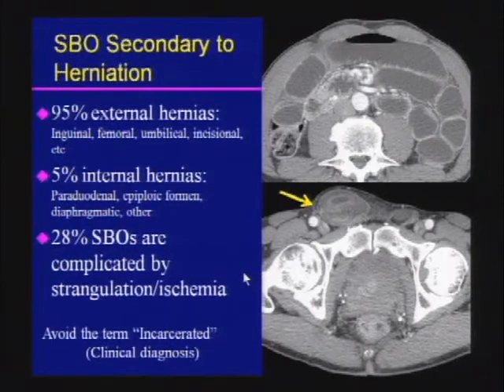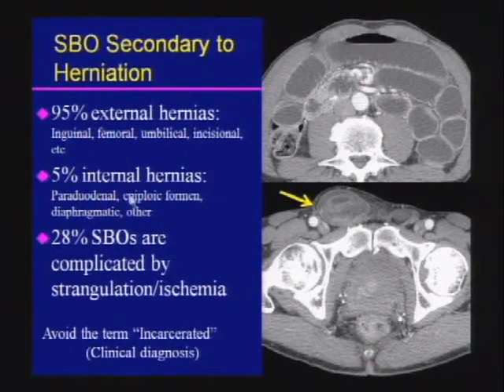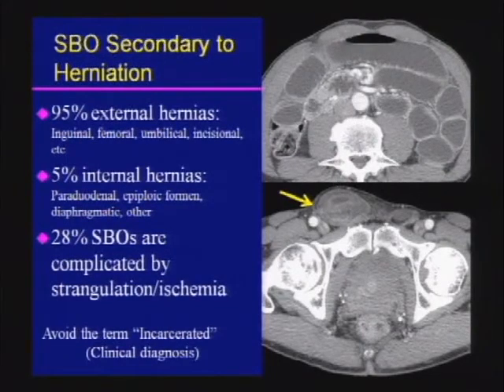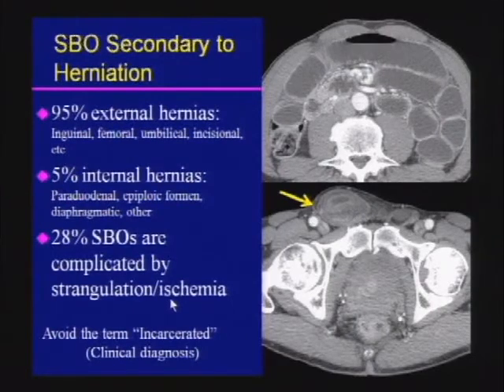A word about small bowel obstruction secondary to hernia: external hernias are the most common cause, with internal hernias making up a smaller percentage, although you should be familiar with the appearance of a paraduodenal hernia and other rare hernias such as the epiploic foramen hernia. We see obvious dilatation involving the right inguinal canal. Try to avoid using the term incarceration on your reports, as this is a clinical diagnosis based on whether the physician can reduce the hernia sac.